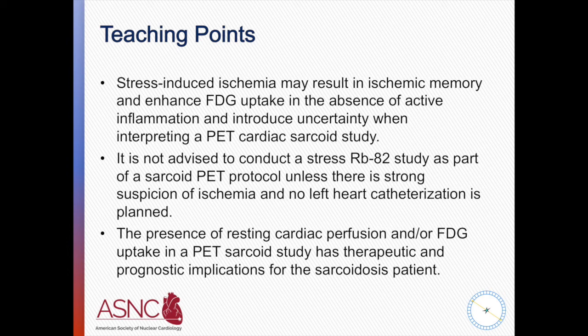It's more of a problem in people with known disease who've had infarcts, who have grafts. In that situation, you may want to do it, but ideally, if you could just do a true resting study without inducing ischemia and then do the FDG, then I think you'll get a cleaner answer.